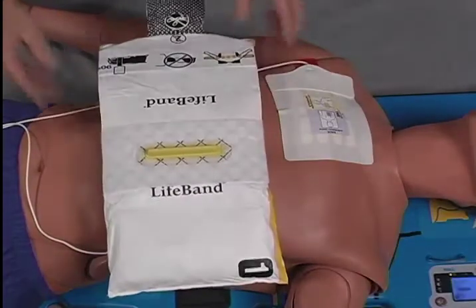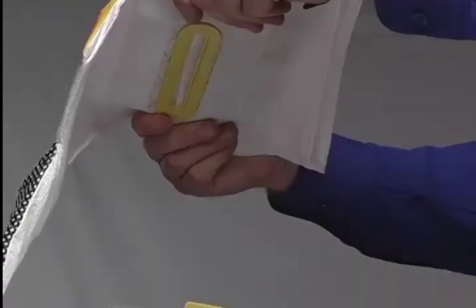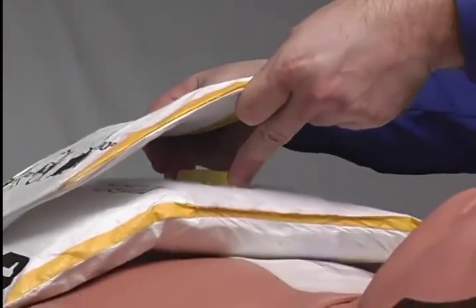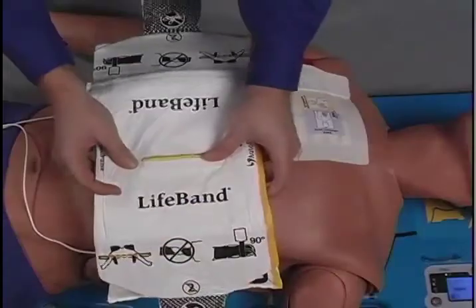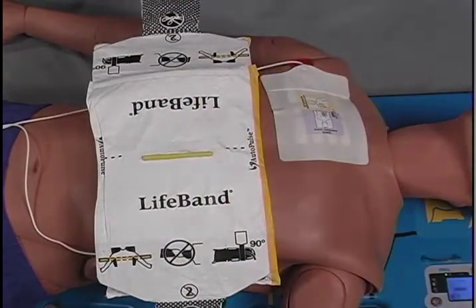Next, close both sides of the life band by placing the side marked with the number one on the patient's chest. Then, use your index and middle fingers to guide the yellow female alignment slot on the bottom side of number two over the yellow male alignment tab on number one, and secure the assembly with the Velcro that is attached to each side.